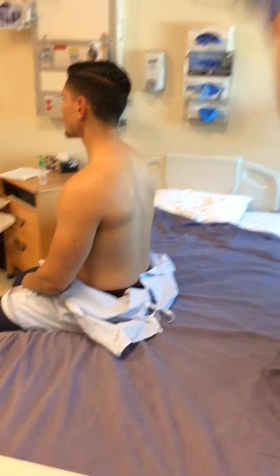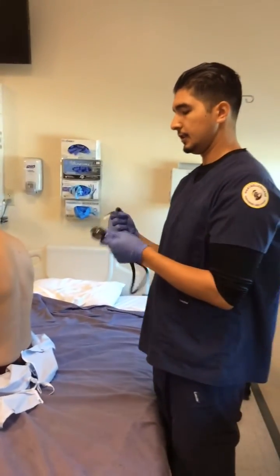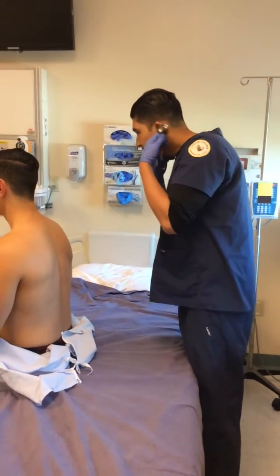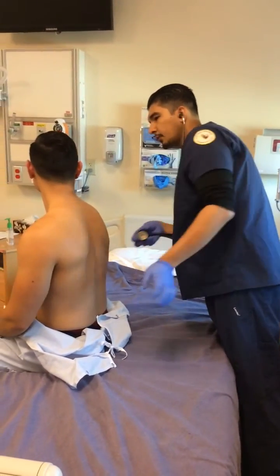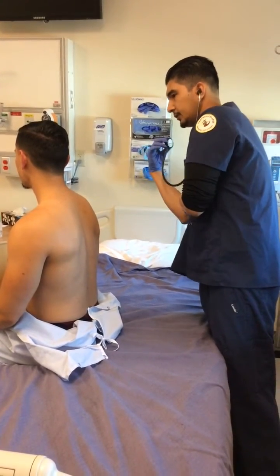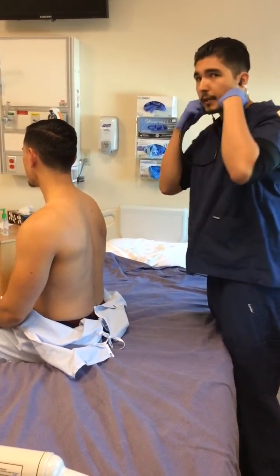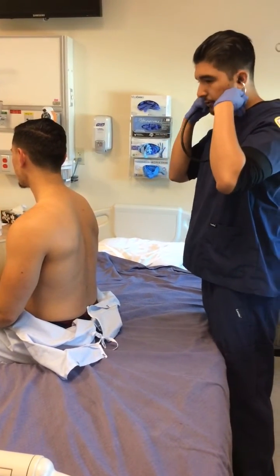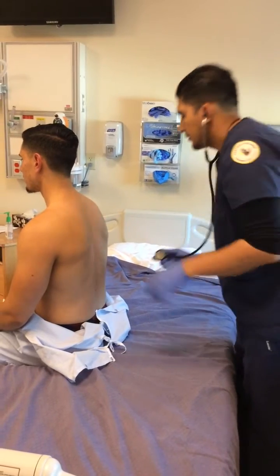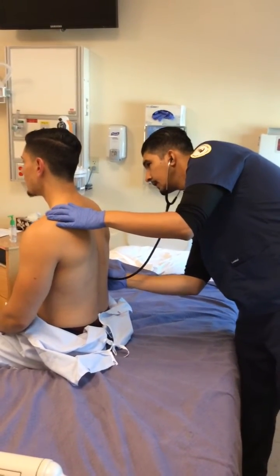So finally, you're going to want to auscultate, and so you're going to be placing your stethoscope on the patient. So I'm going to be placing my stethoscope on you, and every time I move it, I want you to take a breath in and out and exhale. You're going to want to exhale through your mouth. Your patient might get a little lightheaded when doing this, so it's all right if you take a break. So can you take a deep breath with me?